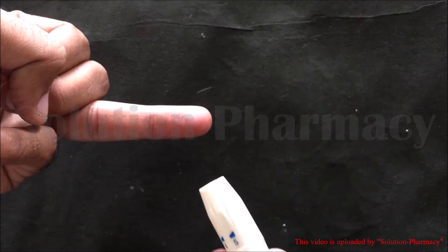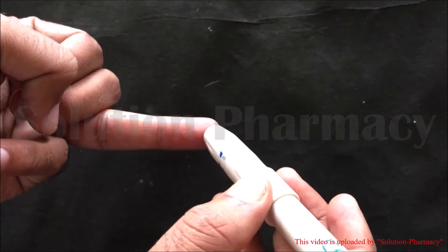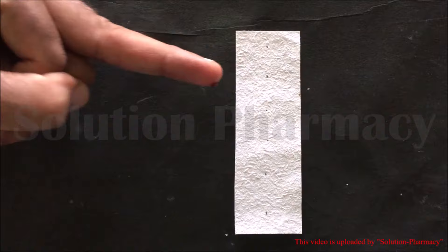Prick the fingertip. After pricking the fingertip, allow the blood to flow freely and then immediately start the stopwatch.